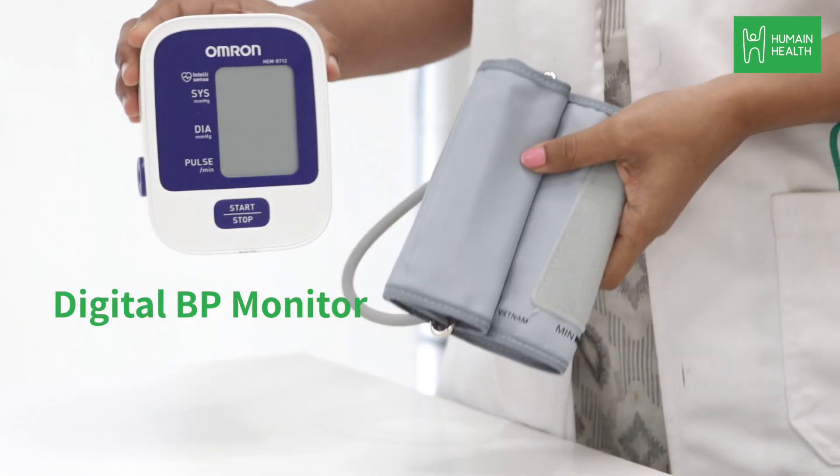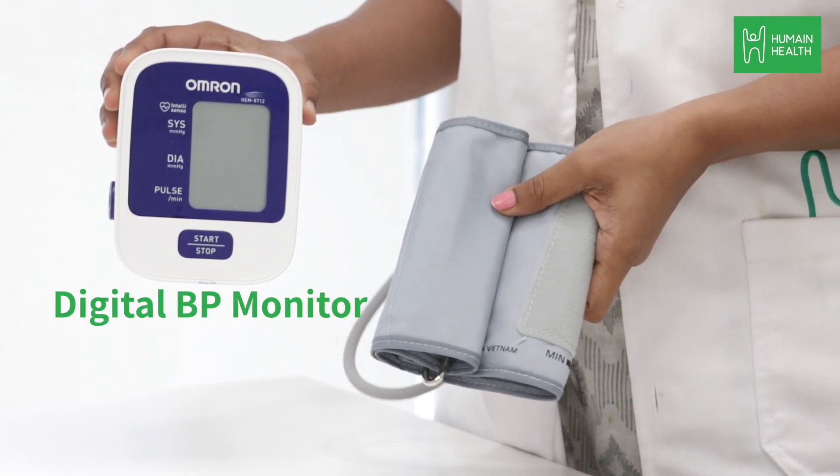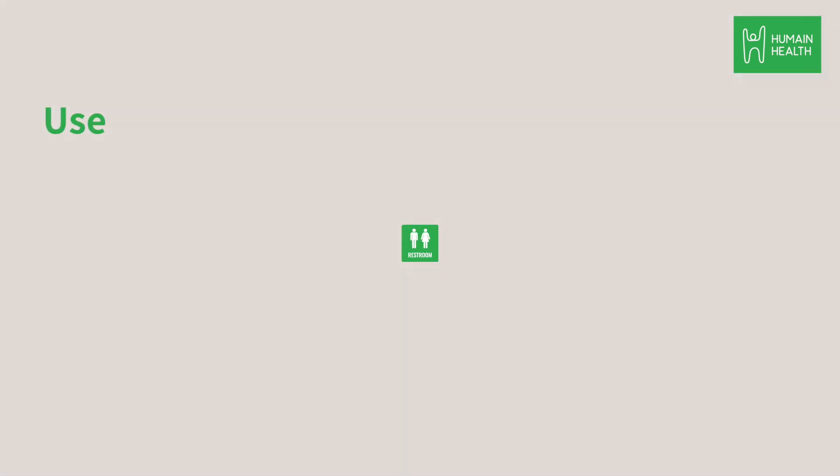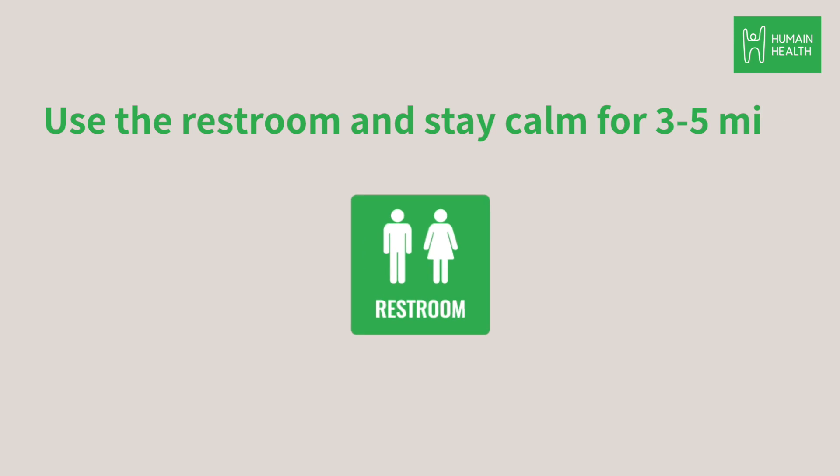This video will help you measure your blood pressure accurately with the digital BP monitor. Before you sit down to do this test, use the restroom and stay calm for three to five minutes.